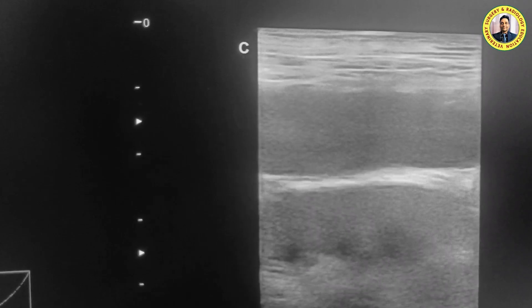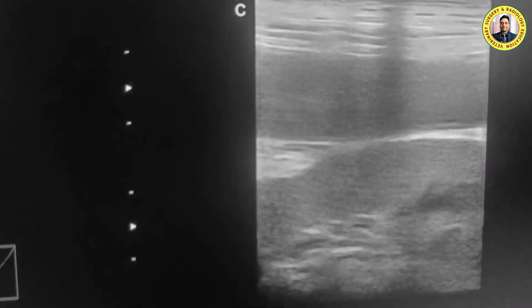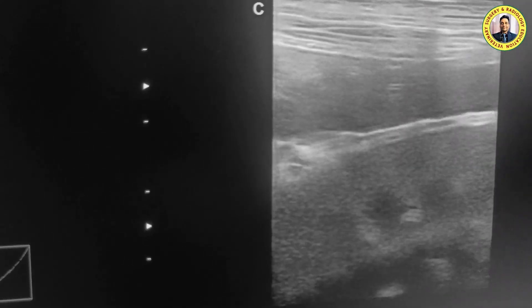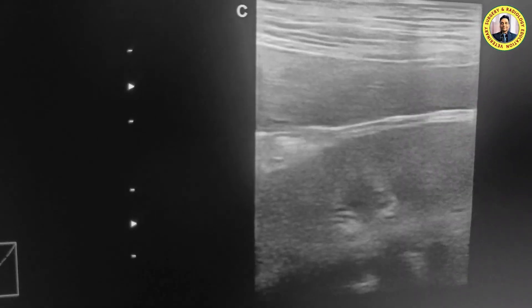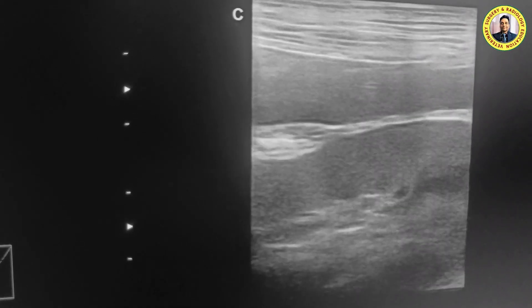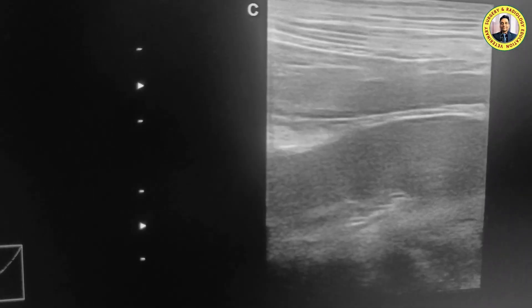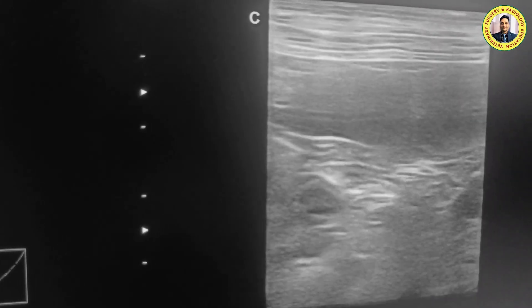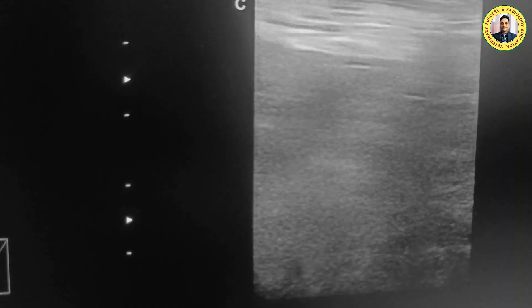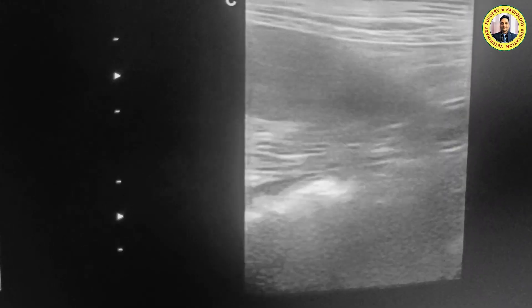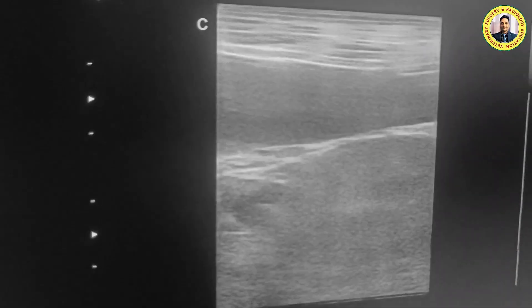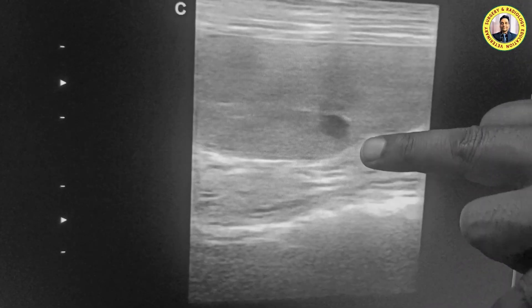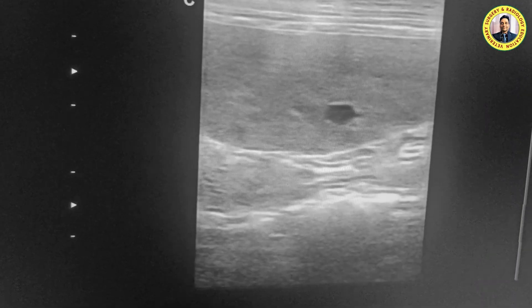Below you can see the kidney, which is very clear. The corticomedullary differentiation is excellent — you can appreciate how beautifully the kidney appears with the linear transducer, with good cortex-medulla differentiation. This one is the hilus of the spleen.